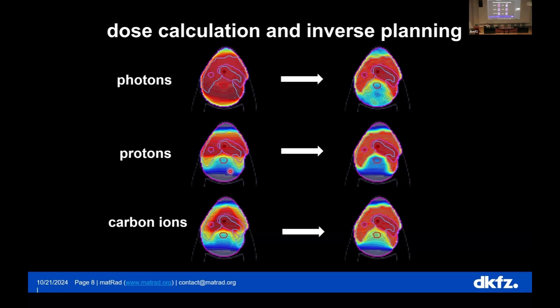So when you know the dose, you need an algorithm that is able to shape this dose and configure the machine to give you something that covers only the targets, instead of, for example, here, where you don't have any idea, so you would just blast the patient with dose. So you need an algorithm that finds a way to shape a conformal dose distribution, as we say it. And we will look a little bit at how these two steps interact in our sessions.